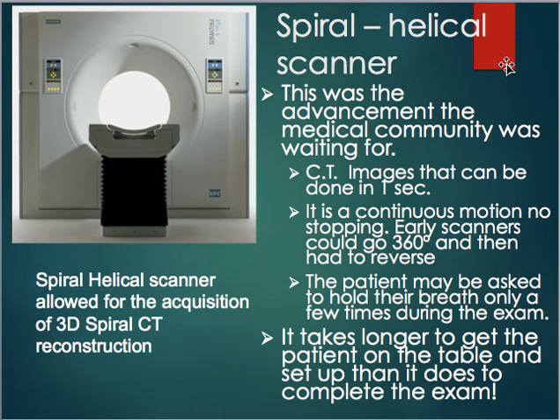Sometimes we have the patient hold their breath during the exam, and the machine tells them when to do that. So when we start the scan, the machine actually says in this really techie computer voice, hold your breath, and then it's, you can breathe. So you don't actually have to tell the patient, the machine is going to do that whole thing all by itself. It actually takes longer to pull the patient's name up on your computer, get them positioned on the table, and do all that than it does to scan them.